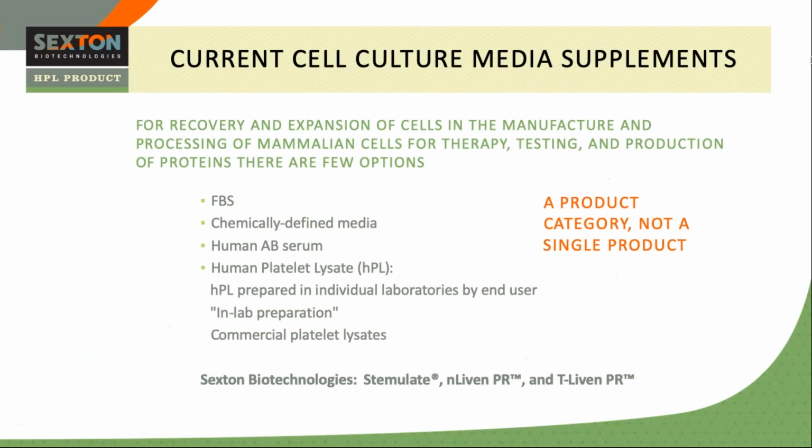And these are some of the ancillary materials which should have such process validation steps underpinning their development and manufacturing. FBS obviously has been used for many years, but is still inherently associated with lots of variability. There has been a shift towards chemically defined media in some cases, but it's not always been possible to replicate cell performance compared with biologically supplemented medias. Then we have the human-derived products. AB serum has become a gold standard for many immunotherapy-associated ATMPs, but there is certainly concern over the availability of a product which is derived from less than 1% of all blood donations. Furthermore, the varied lifestyle of donors, such as diet and level of exercise, often leads to lots of variability.